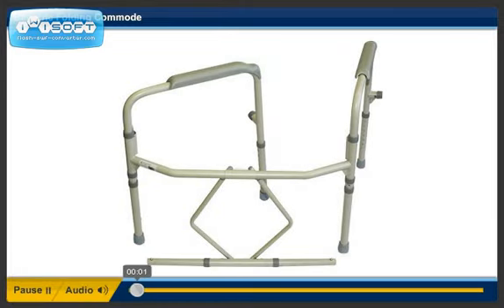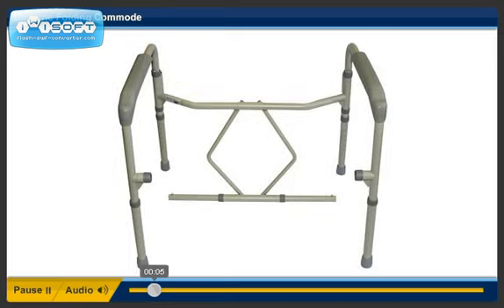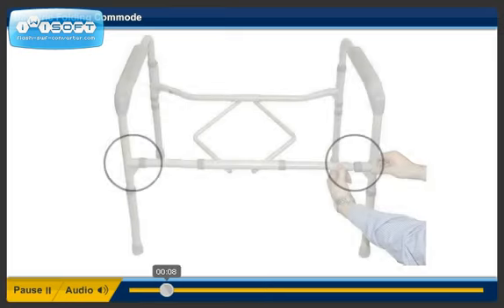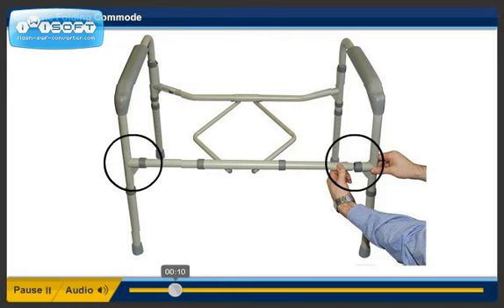Step 1. Unfold the sides of the commode to the front of the commode. Step 2. Insert the front frame into receptacle on each side.